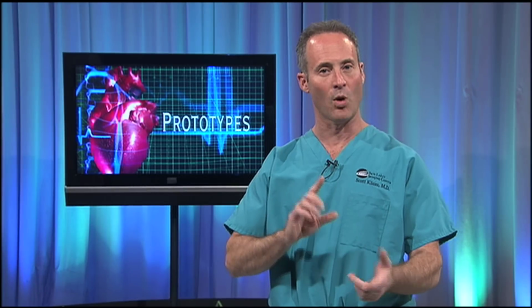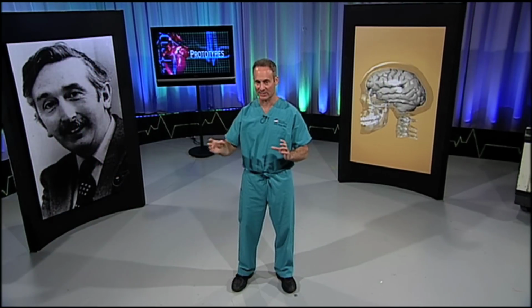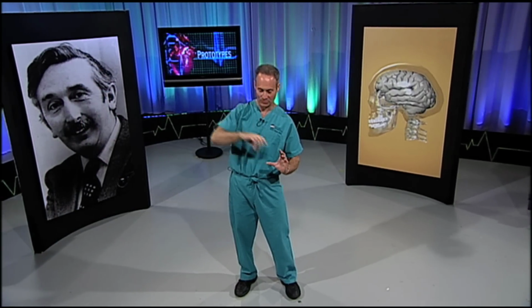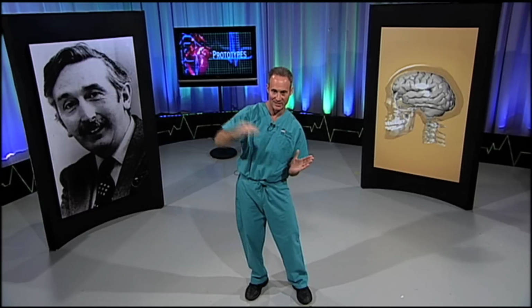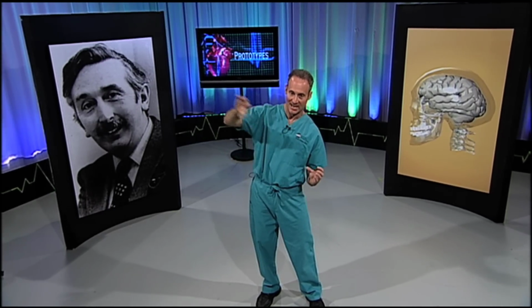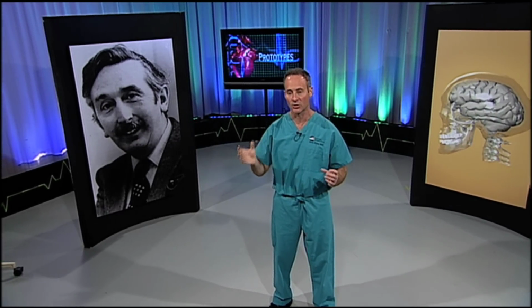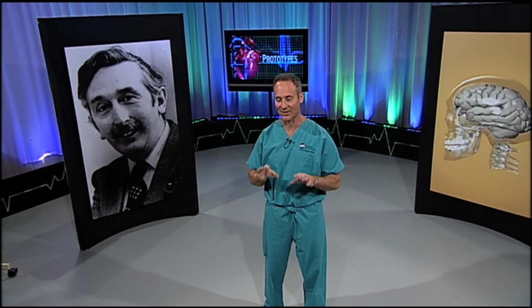Now you may be asking, why do we only go 180? Remember, we're using X-rays. And X-rays, if you start at this angle and pass through the object and record the information over here, basically, you're going to get the same information if you start here and pass it through this way. The X-rays are passing through the body. So you only need 180 degrees to get complete information about everything inside the body.